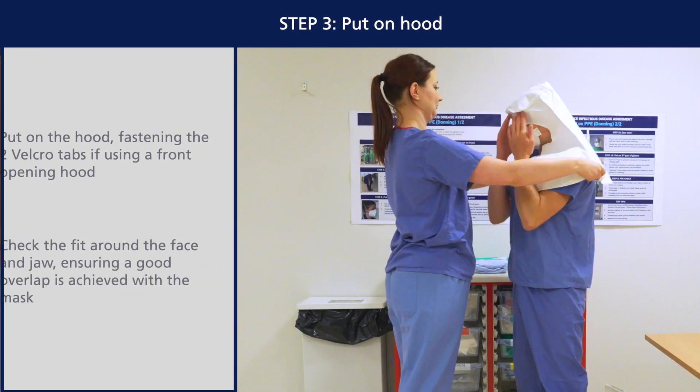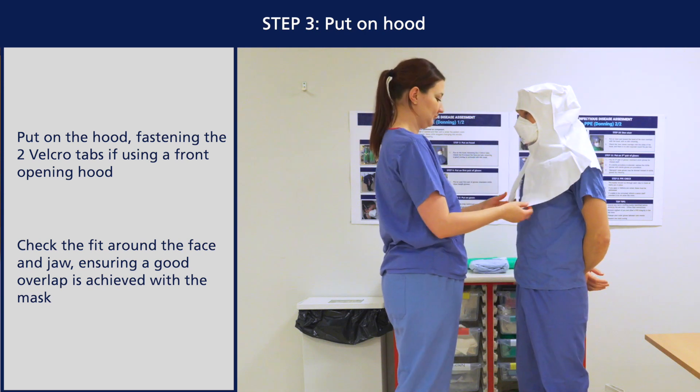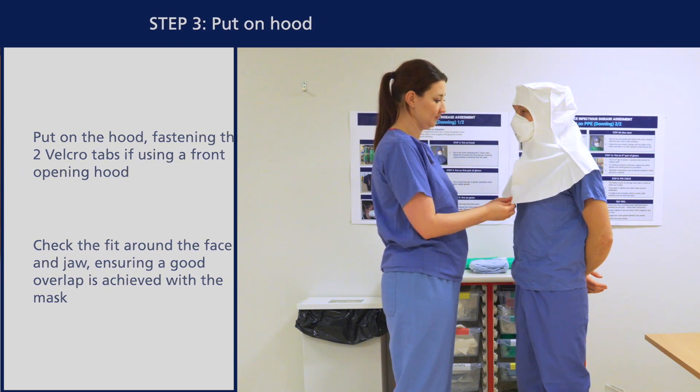Put on the hood, fastening the velcro tabs if using a front opening hood. Check the fit around the face and jaw, ensuring a good overlap is achieved with the mask.